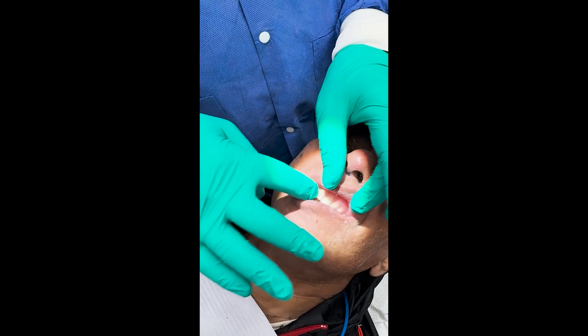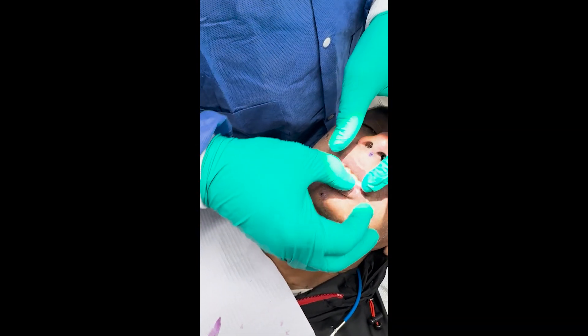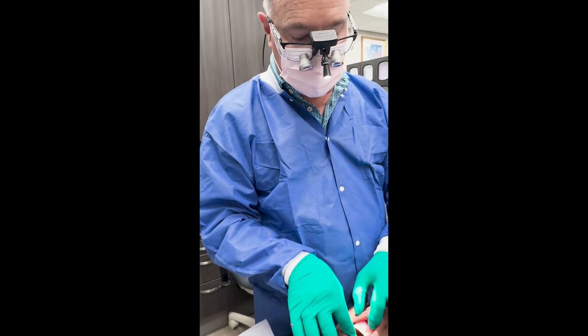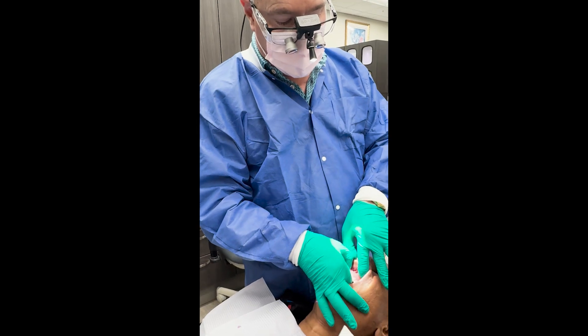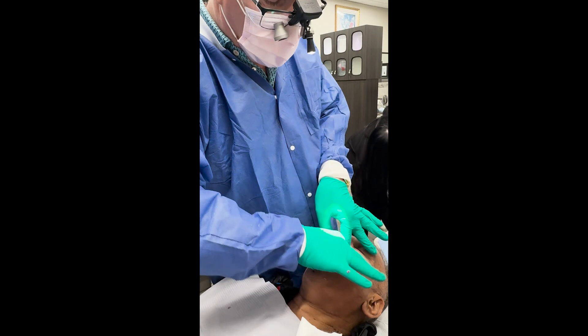We are going to have the lab put some pink Xantex material up here above the teeth. Now we're in good shape. We're going to take an impression of his existing denture so the lab can get the teeth similar to that shape, because they look nice in his mouth.